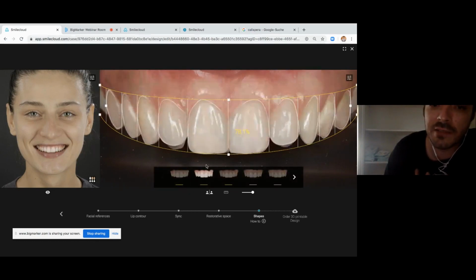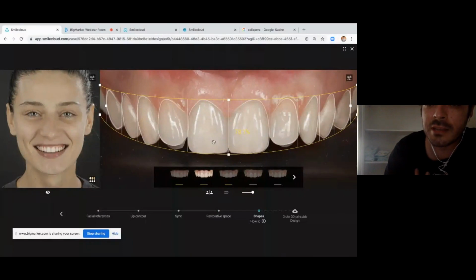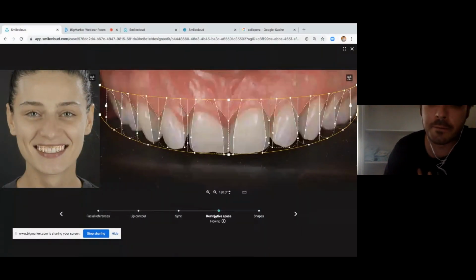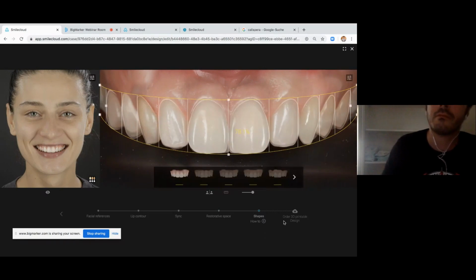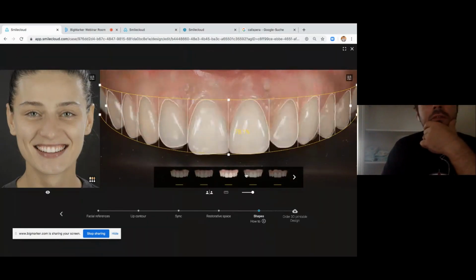the results all take into account this specific search criteria, which means whenever I'm going to use these libraries, a lot of time to wax them and alter their shapes. It's an iteration, and this reduces a lot of the alterations you need to do on the designs.